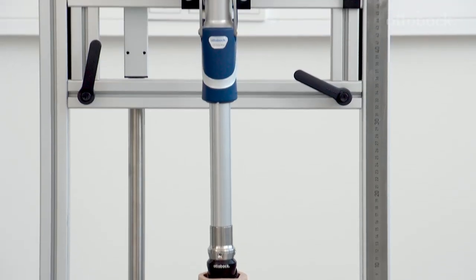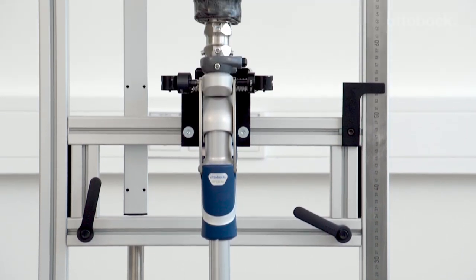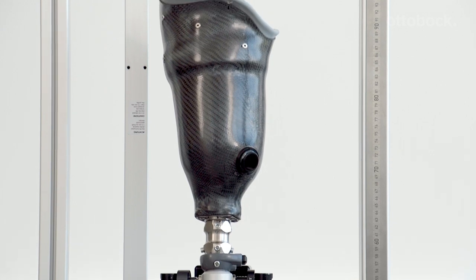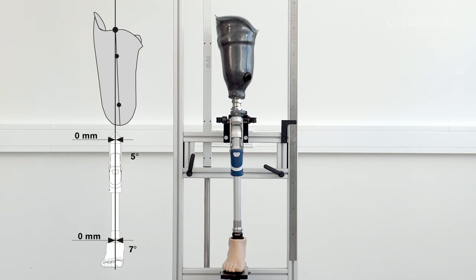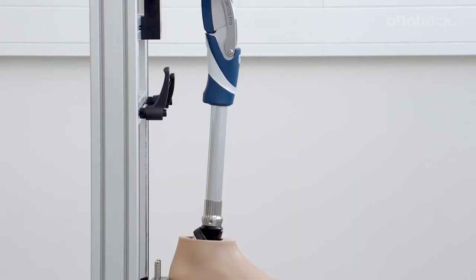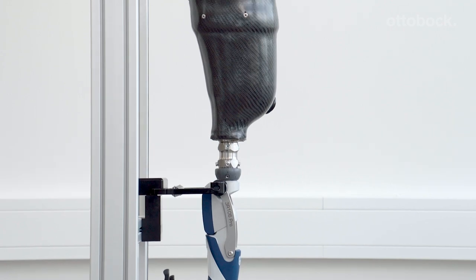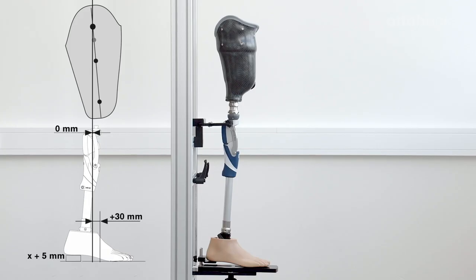The alignment and adjustments are easily completed in the following steps: Bench Alignment, Static Alignment, and Dynamic Trial Fitting. Please refer to the displayed table for the correct bench alignment values.